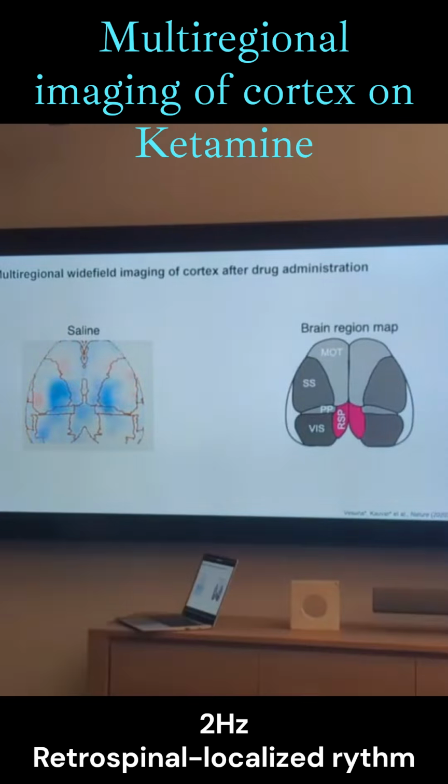Truly fantastic video. This is looking down on the brain of a mouse that is awake. Its head is fixed in place under the microscope, and it's just sitting there thinking. And this is a mouse brain thinking. And it's really mind-boggling.